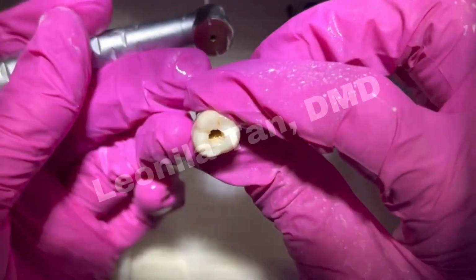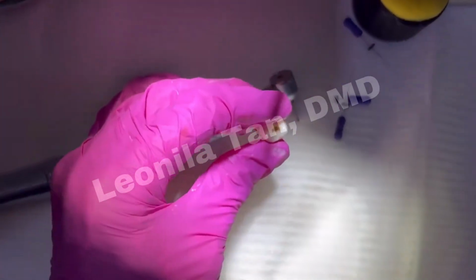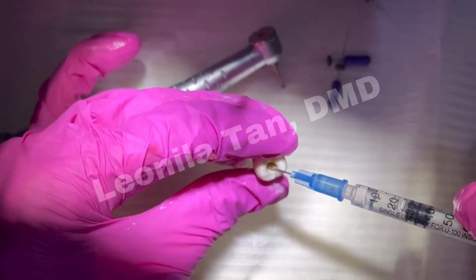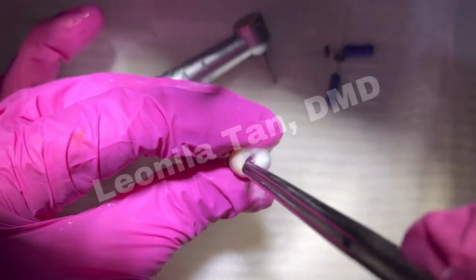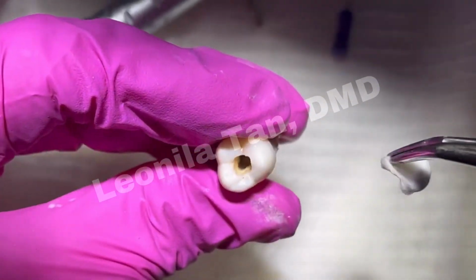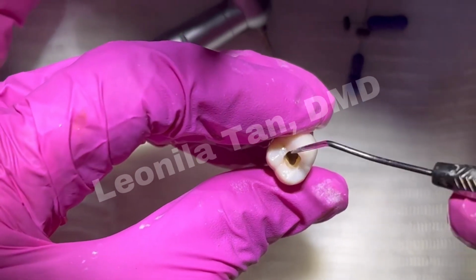Okay, so let's check. Irrigate. Okay, dry. Check with your explorer.